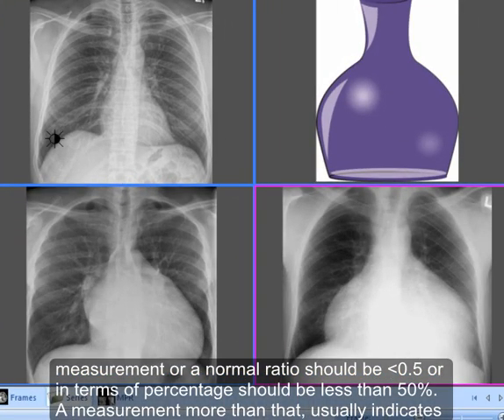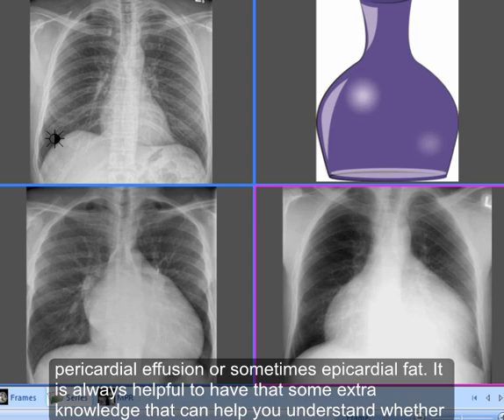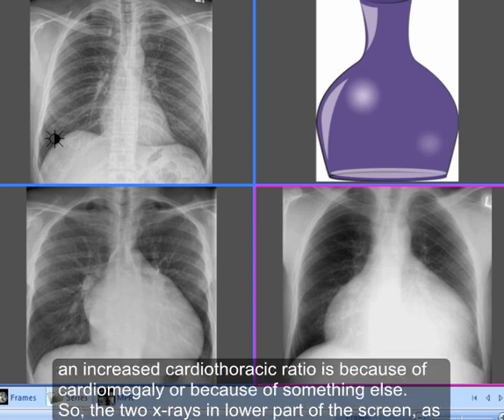A measurement more than that usually indicates cardiomegaly, such as in ventricular hypertrophy or as a result of mitral valve stenosis, but at times it can be due to other reasons such as pericardial effusion or sometimes epicardial fat. It is always helpful to have extra knowledge to help you understand whether an increased cardiothoracic ratio is due to cardiomegaly or something else.